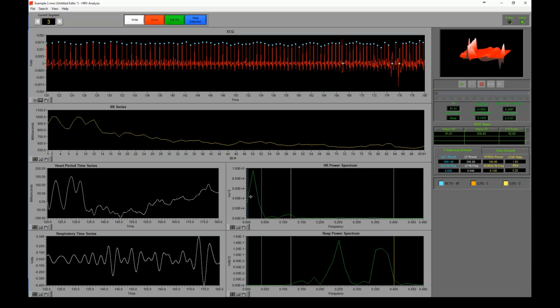And then we pass it through a fast Fourier transform, which takes it from the time domain, what we see up here, measured in seconds, to a representation of the same waveform, where we're instead looking at what are those frequencies that make up this complex waveform and how strong are they. And from there, we want to drill down even farther and say, we really care about the strength within these specific frequency bands.